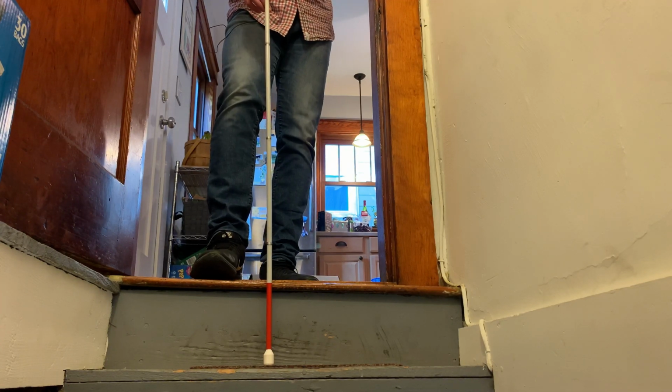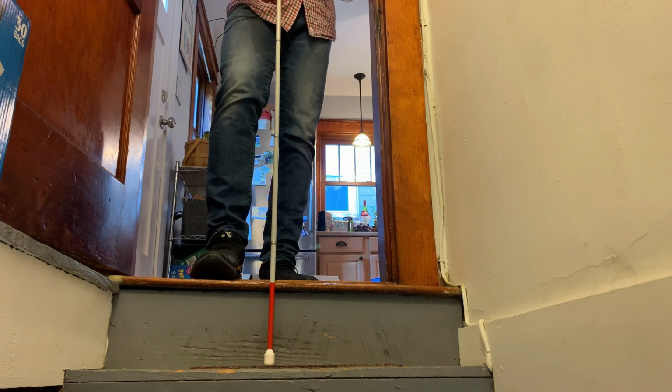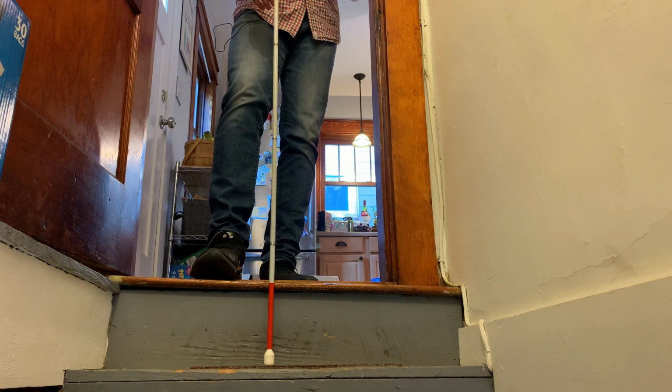If there's a hand railing, this would be a good time to grab it if you need the hand railing. Unfortunately, these stairs don't have a hand railing up here, not till I get lower down the stairs. And then, after you check where your placement is on the stairs, you want to check how high and how wide the stairs are.